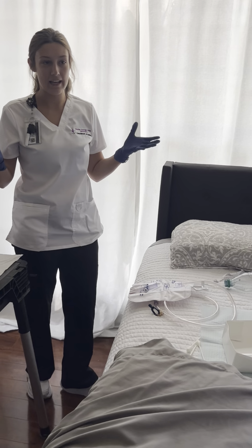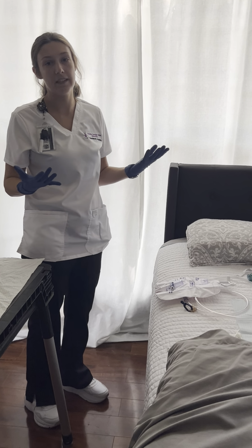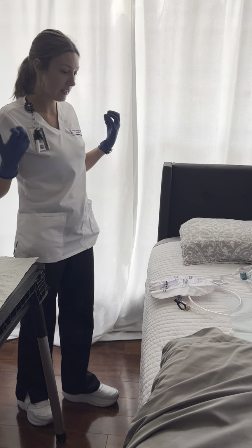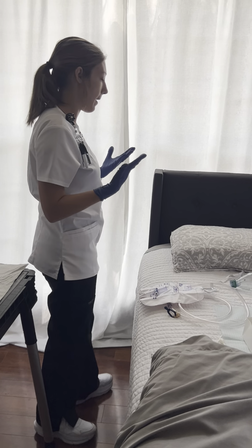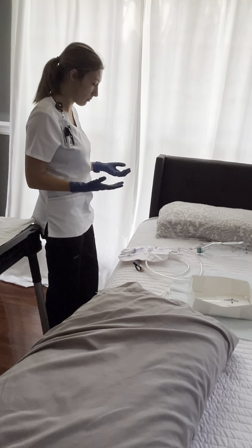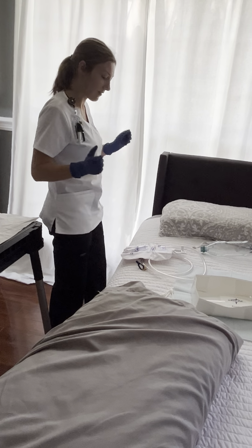So now we'll say it's been a day or two later. We got an order to remove the Foley catheter. So I'm going to come in, introduce myself, do hand hygiene, provide privacy, and don clean gloves. So I'm going to tell the patient, Ms. Smith, we got an order to remove your Foley catheter today. Although it is going to be a little uncomfortable, it's not as painful as when we put the catheter in. Is it okay if I do that today? Okay, thank you so much.